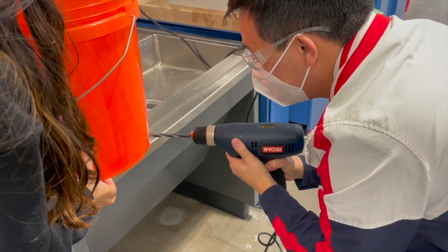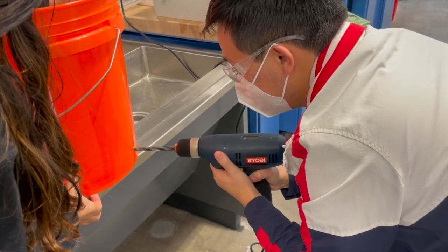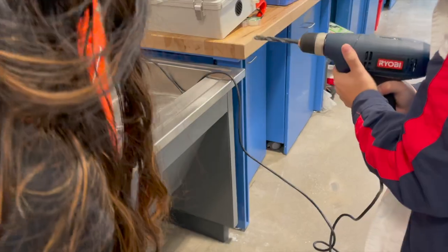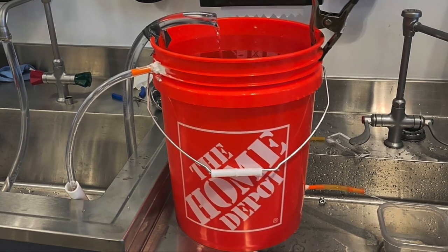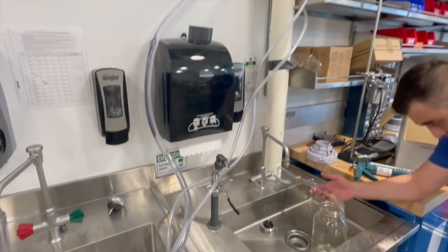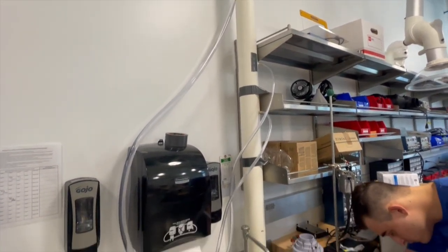For proof of concept testing, the team initially constructed a bench test to simulate the pulmonary artery flow and pressures of our target population using a bucket on an elevated surface. Over the course of the project, we constructed a more robust test setup to measure the percent reduction in flow using water.